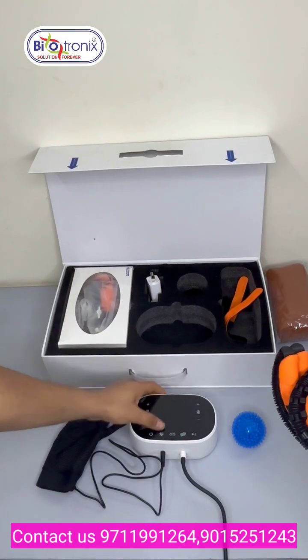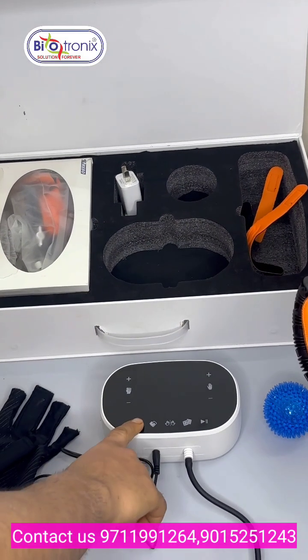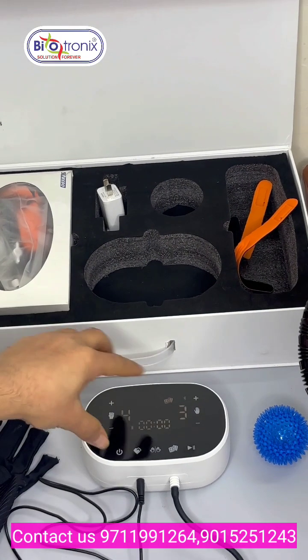This is the host device. This is the rechargeable unit. I have already charged it. Now I have to long press this power key to turn the machine on.